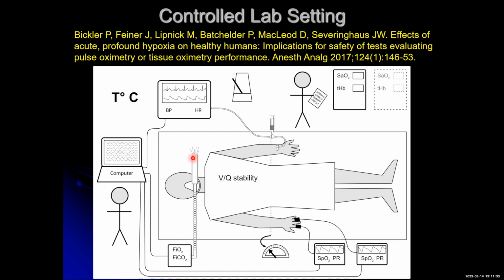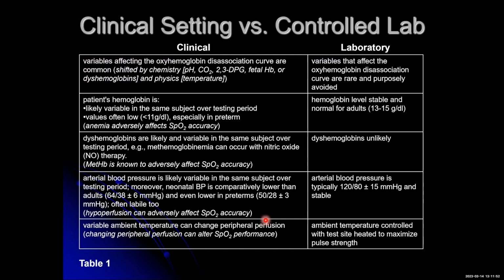And you have a variety of gas mixtures that are breathed. And we heard a bit about that earlier. And then multiple oximeters that are in place to make sure that the data are correlated with a reference pulse oximeter as well as the oximeters under test. Now, there's a large number of variables that can affect the precision of getting the best comparative data possible.